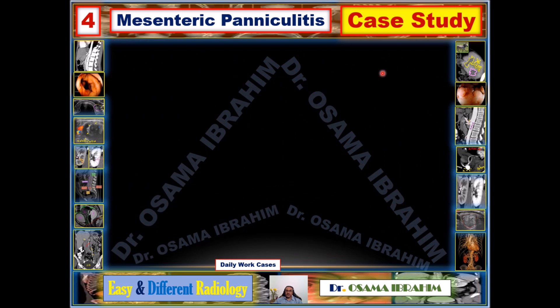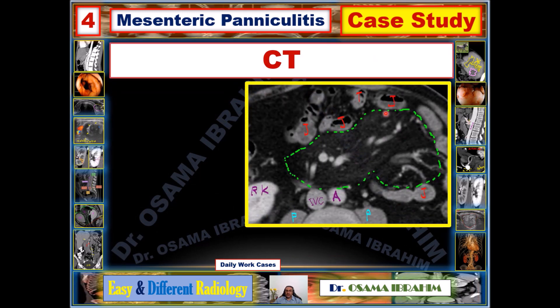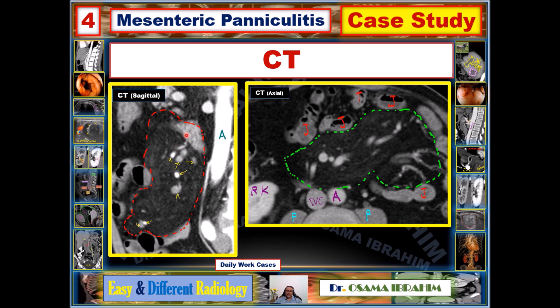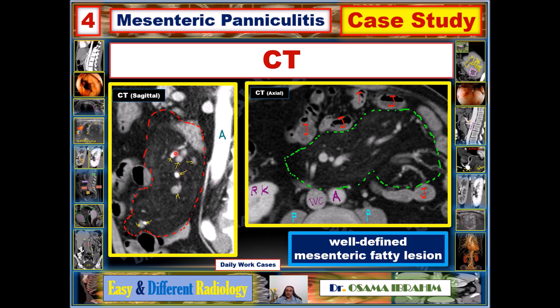The same patient's axial CT images show fatty lesions with mesenteric vessels inside, adjacent to jejunal loops, the aorta, IVC, and right kidney. The sagittal view confirms the presence of hyperattenuating mesenteric fat within the mesentery, which is diagnostic for mesenteric paniculitis. Note the yellow arrow pointing to the patent vessels within the mesenteric fatty lesion, confirming the diagnosis.